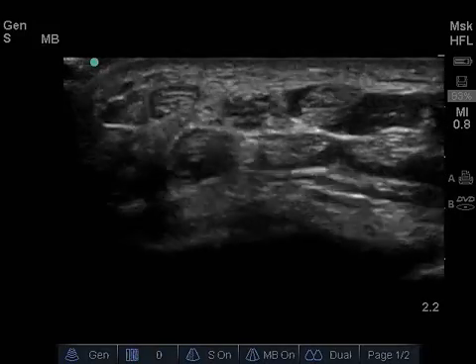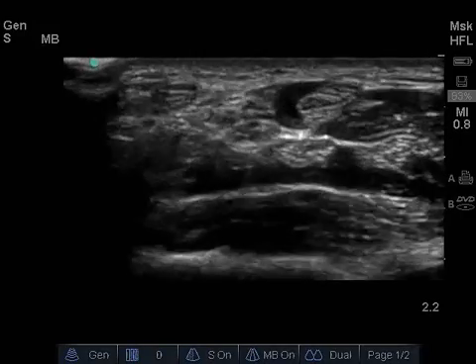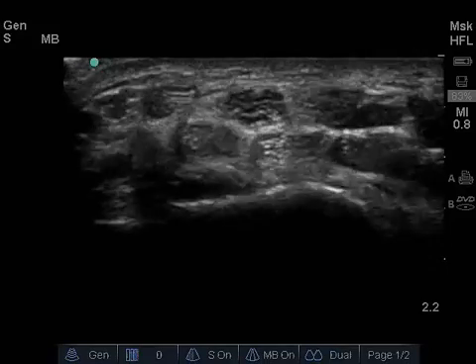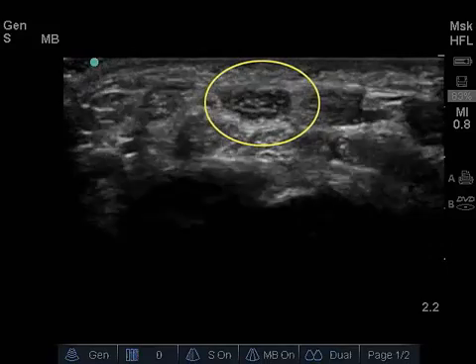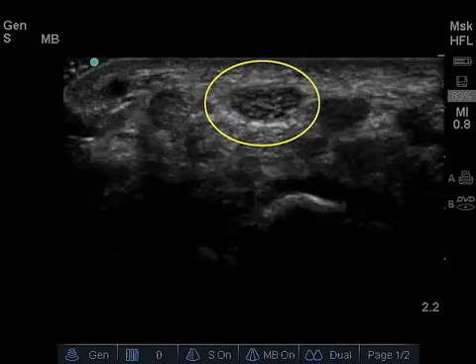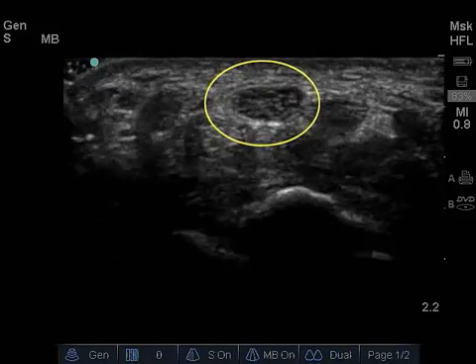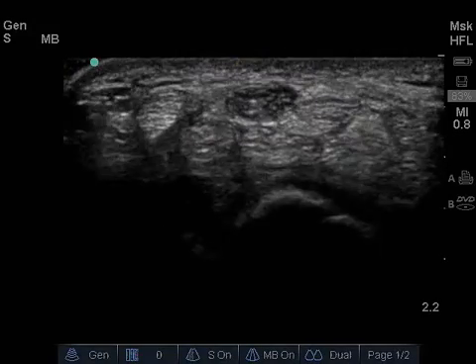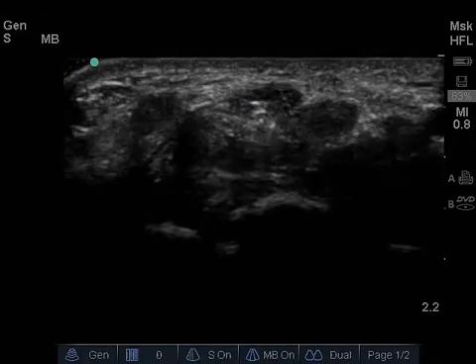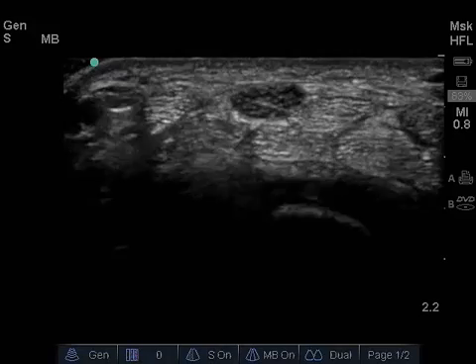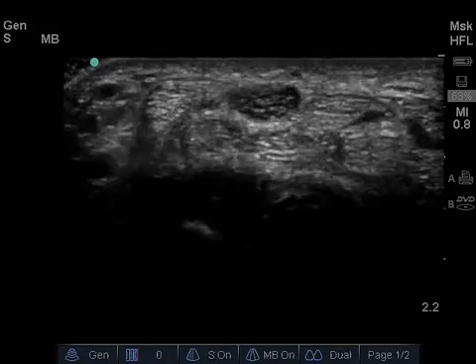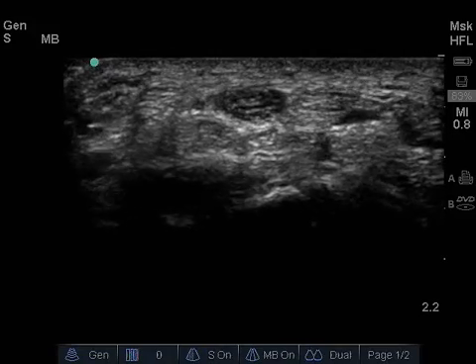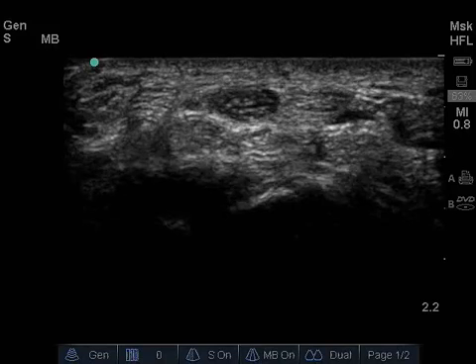Carpal tunnel syndrome may be recognized by hypoechoic swelling of the median nerve at the proximal portion of the carpal tunnel due to intraneural edema or fibrosis. The fascicular pattern typical of peripheral nerves may be partially lost as the normally hyperechoic connective tissue components surrounding the nerve fascicles become hypoechoic.